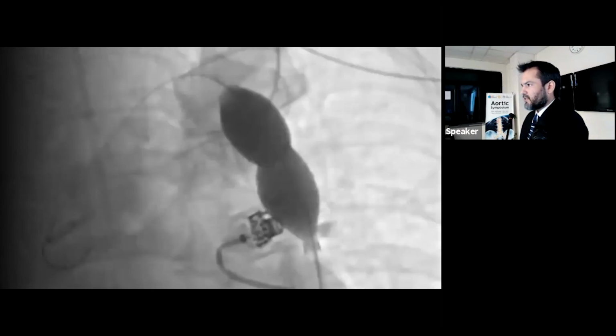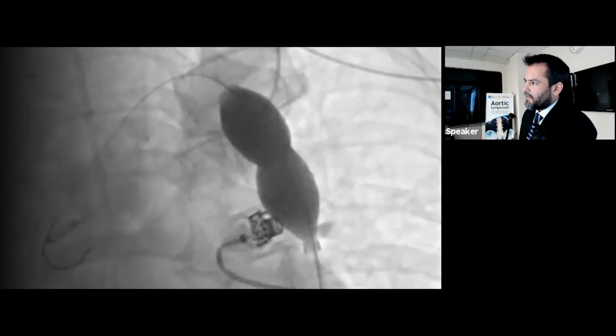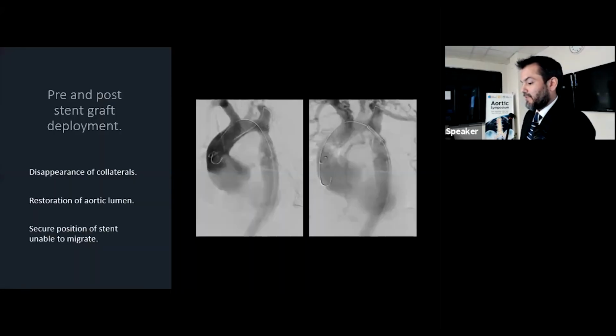What can happen when you're doing this is that you can rupture the aorta. If you rupture the aorta focally, not a problem. We've got a stent graft in position. Our stent graft is not very long. So if we dissect it and have a significant rupture, the patient will be dead within a few minutes. Fortunately, we have a TEVAR standard Medtronic stent graft in the angio suite lying right there to be opened and deployed within a matter of 2 to 3 minutes. Stiff wire is there. We've got surgical cut down. We just have to open it and deploy it. We've not had to do that, and this patient did very well.